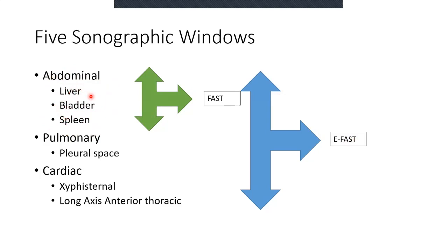We can look at diaphragmatic disruptions. We can look at kidney disease. There's a lot now that can be done in the emergency department that couldn't be done 40 years ago, number one because of the clarity of the picture that we get even on the most basic machines.